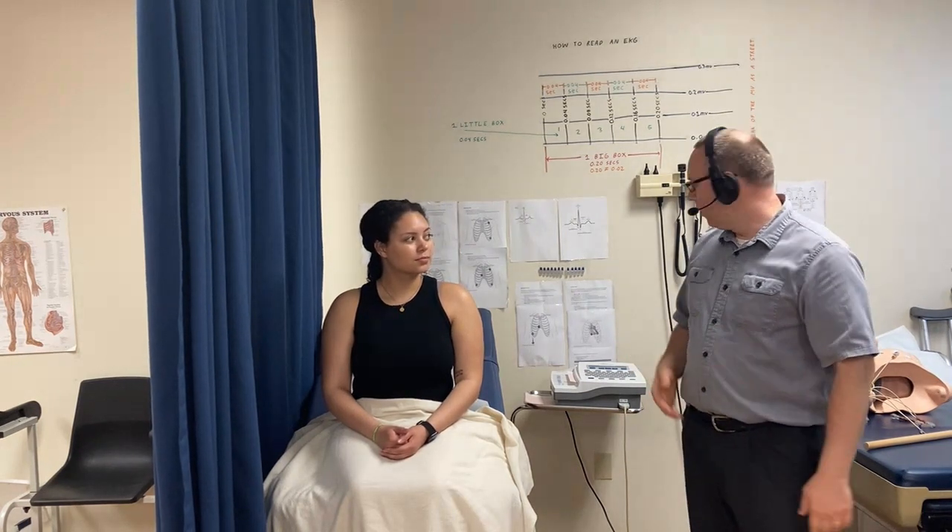We have a patient here complaining of chest pain, shortness of breath, and maybe some extra heartbeats. We're going to get an EKG, and I'm going to show you how to do it. First thing — introduce yourself: 'Hey, I'm Dr. Perkins, how are you doing today?'